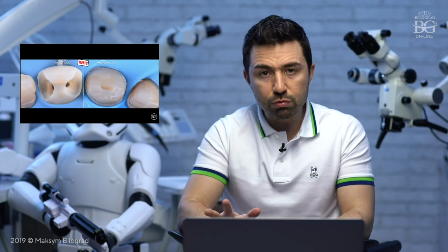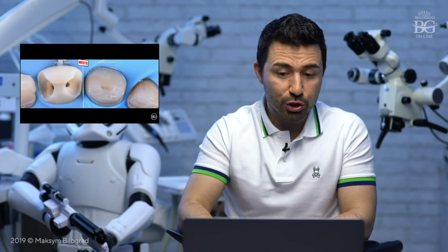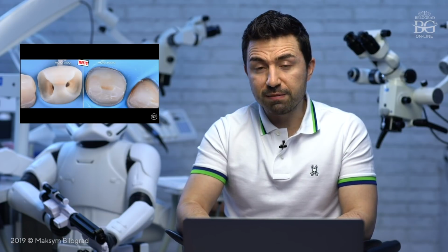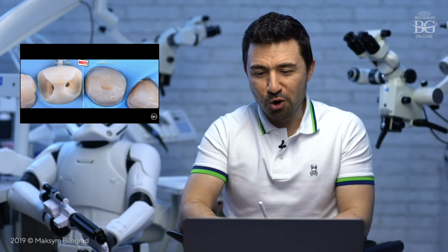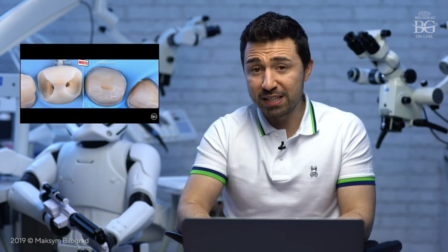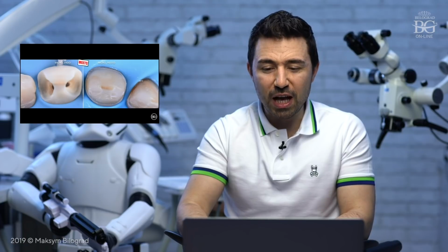So you have to cooperate with dental technicians, or you have to push your dental technician also to use magnification or microscopes. And to be honest, the cost of a microscope for dental technicians is not the same as a microscope for dentists. So when some dental technicians complain that microscopes are expensive, it is not true. Maybe it's because your dental technician doesn't want to get out of his comfort zone.